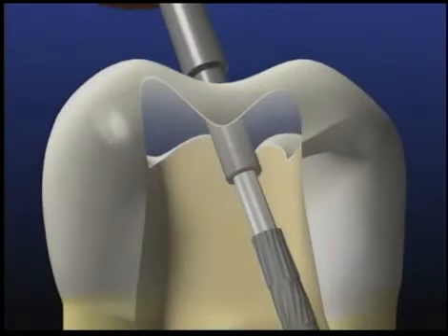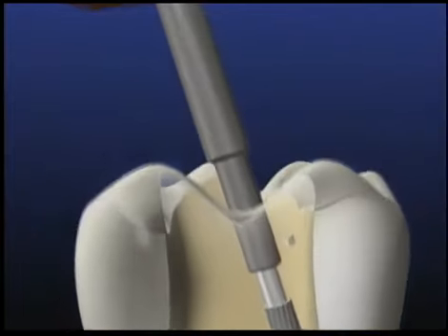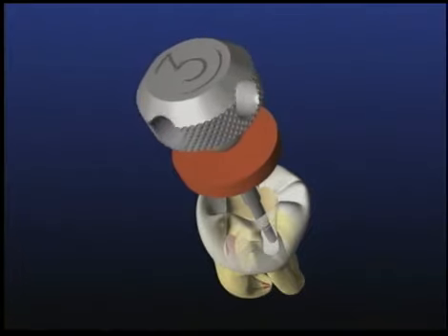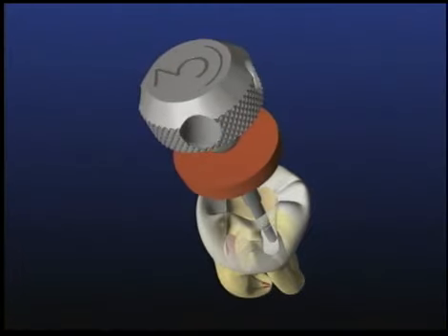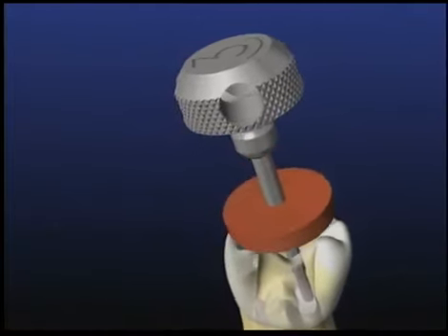Place the tap over the machined-down post, push it firmly in an apical direction, and screw it on using small quarter-turn counterclockwise rotations. The tap forms threads on the post and is drawn down until snug. Slide the cushion down so it contacts and protects the tooth.